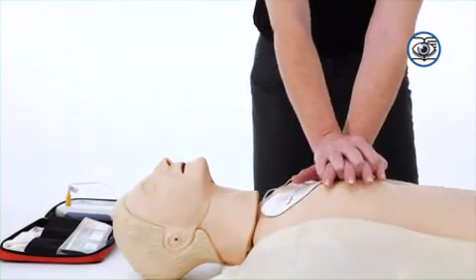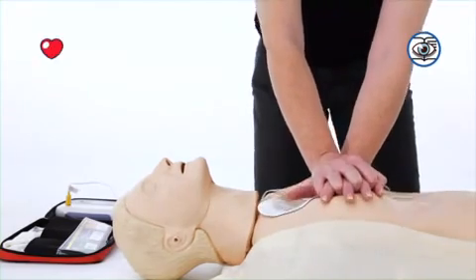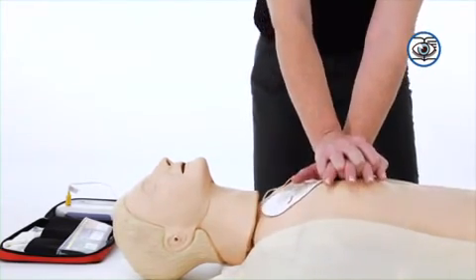The defibrillation pads, once applied to the chest, should not be removed by the CFR.